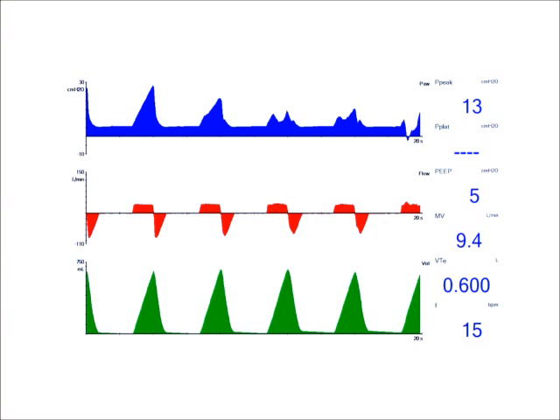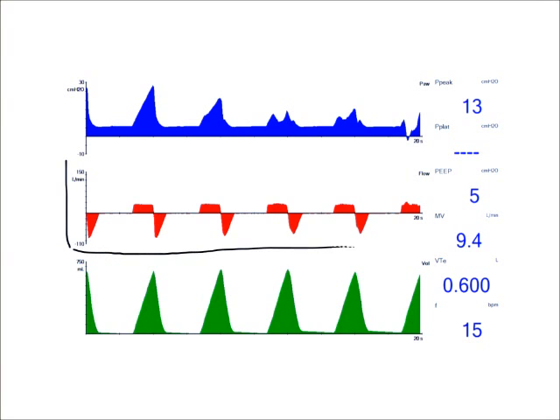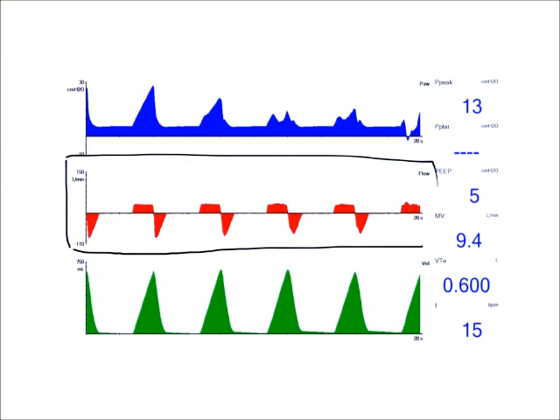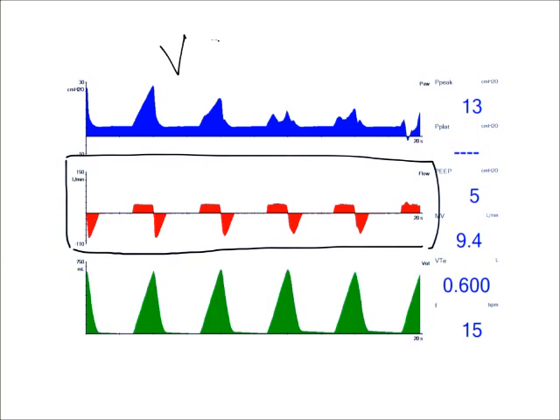So if we view this screenshot of the ventilator here, I'm going to be looking at my flow waveform to describe my inspiratory time. So here's my flow waveform. My flow is in red, and this is volume control ventilation, and my flow is constant.